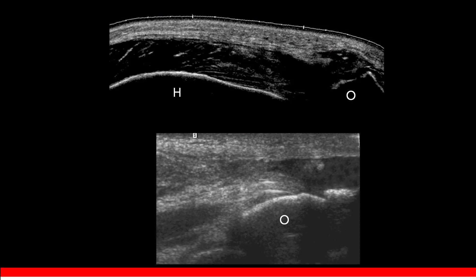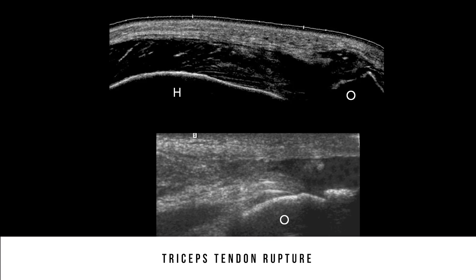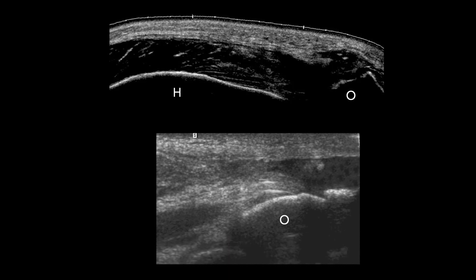Here is a case of triceps tendon rupture, a relatively rare injury that occurs in high-level athletes during forced hyperextension. You can see a gap where the triceps tendon normally inserts, which is now filled by a hematoma.